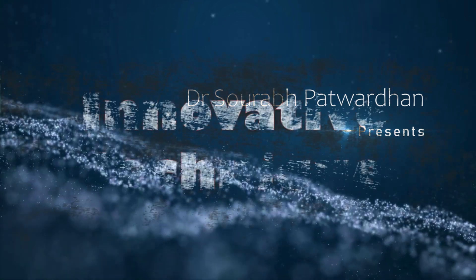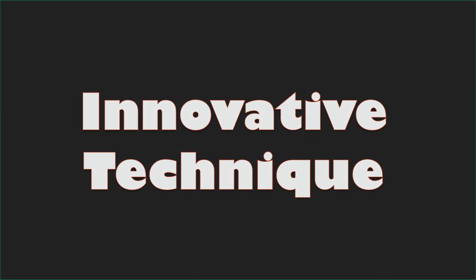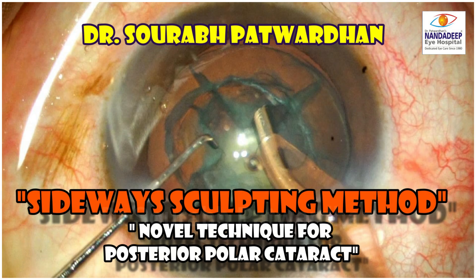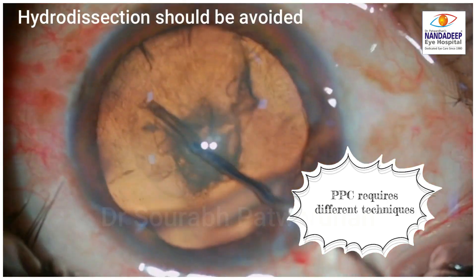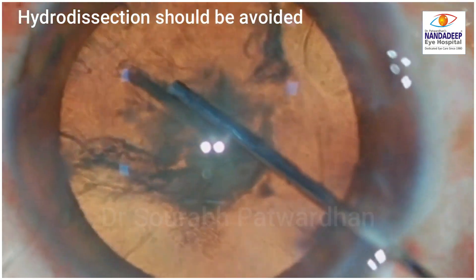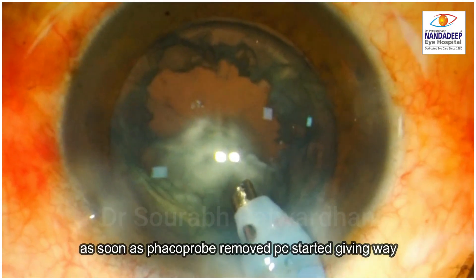In this video, I am describing an innovative technique particularly used for posterior polar cataract called the sideways sculpting method. In cases of PPC, there is a deficient or weak posterior capsule, and we must avoid hydrodissection, otherwise it will rupture and may lead to loss of nucleus in the vitreous cavity.